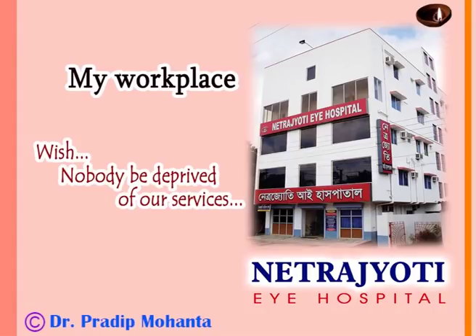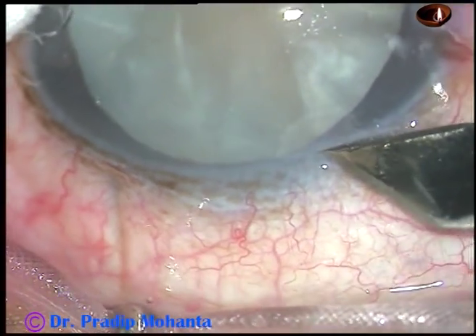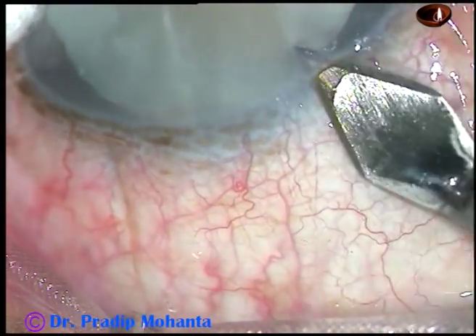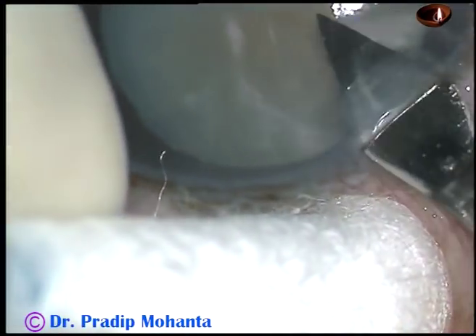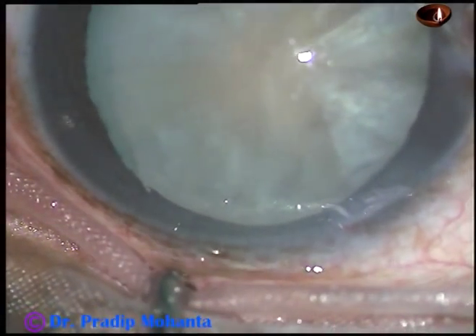Dear colleagues, welcome to my hospital at Ranaghat, West Bengal, India. In this video, I want to show capsulorhexis in an intumescent cataract as well as in a hypermature Morgagnian cataract. This is the intumescent one.